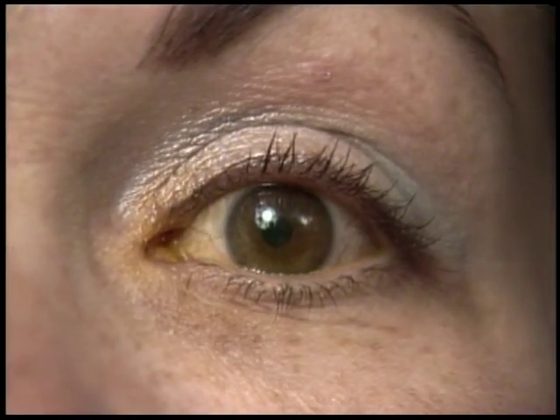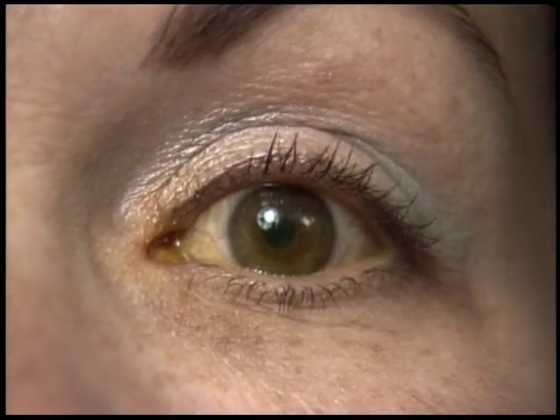If there is too much fluorescein, often from induced tearing, there will be a wide meniscus and an artificially high intraocular pressure reading. If there is too little fluorescein, which may result from evaporation of the stained tear layer during protracted measurement or in a dry eye, the meniscus will be thin and intraocular pressure will be falsely low. The patient should be told to blink several times and the measurement repeated. If pulsatile movement of the mires is noted, the final adjustment should be halfway between the 2 extremes.